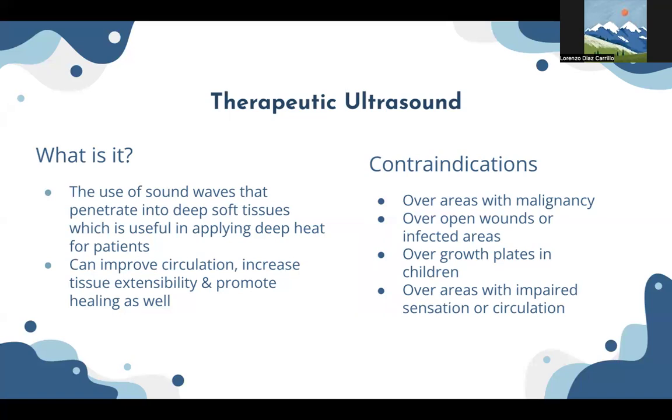a great way to get that deep heat, and the contraindications are very similar to these other ones, where you don't want to do these over areas with any malignancy, open wounds, or infected areas, over growth plates in children specifically, or areas with impaired sensation and circulation.